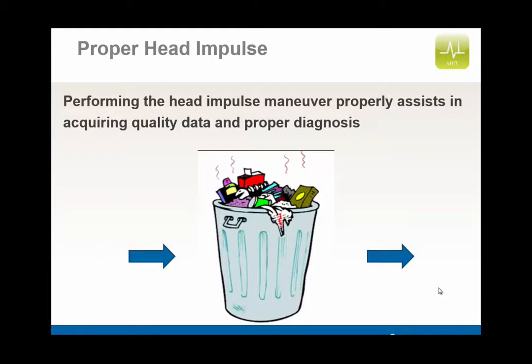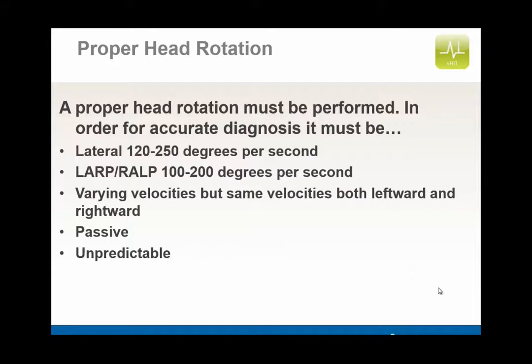Now, obviously, performing a proper head impulse maneuver properly assists in acquiring quality data and proper diagnosis. So I hate to say it, but you know, garbage in, garbage out. If you're not doing a good job in collecting your data, then you really can't use it to properly diagnose a patient. So let's talk about head rotation.